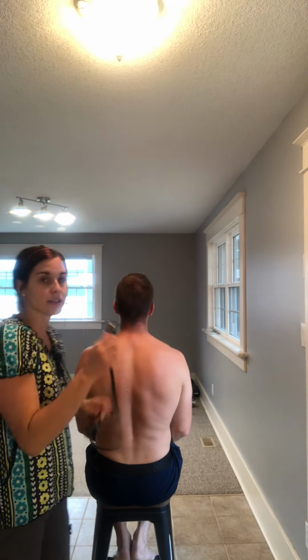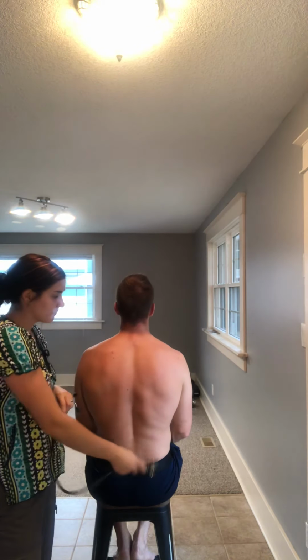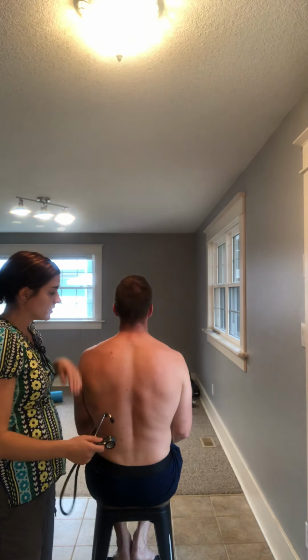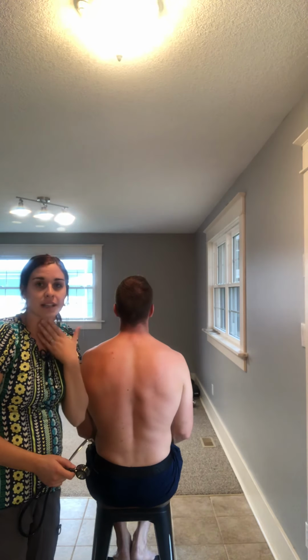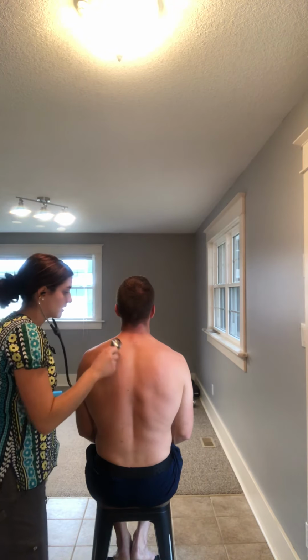So I'm going to auscultate with the diaphragm of my stethoscope and listen in a ladder pattern. I'll be hearing vesicular sounds, much more low-pitched over most of the lung fields. Bronchovesicular in the first and second interspaces, bronchial close to the manubrium, and then tracheal sounds are over the trachea. So I'm just going to get you to take a deep breath in and out.